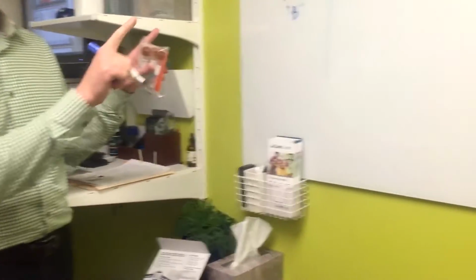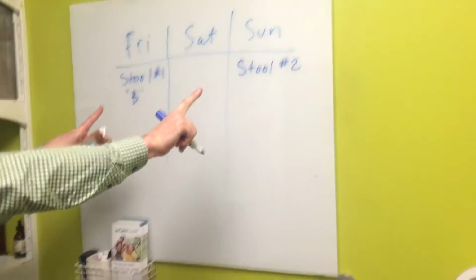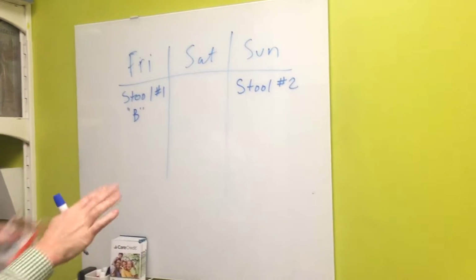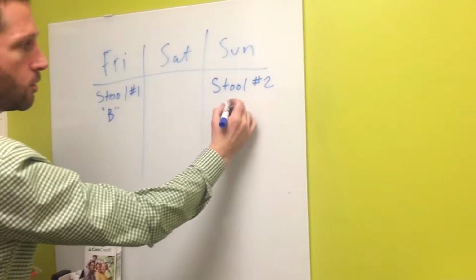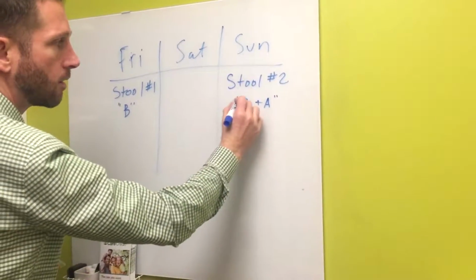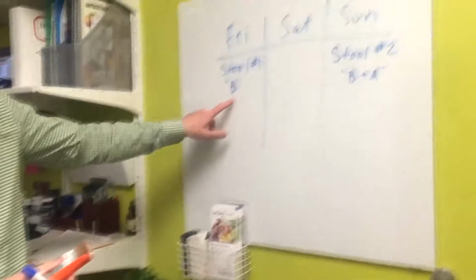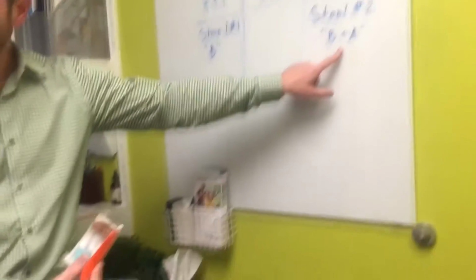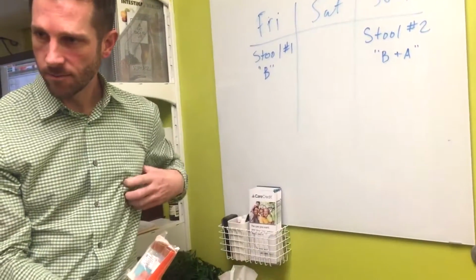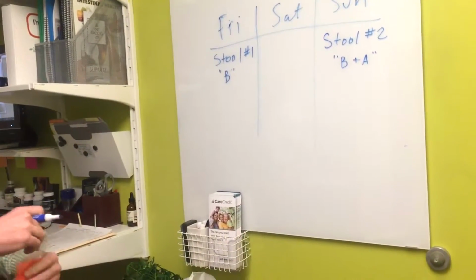So the lab wants you to have 2 different collections with a day in between so they can do a comparison analysis. On stool collection number 2, you're going to be doing the B and an A together from the same stool. So you do the first one, which is a B, and then you finish off and fill up the last 2 on Sunday. Does that make sense? Does it matter what time during the day? Nope. Just whenever you gotta go to the bathroom.